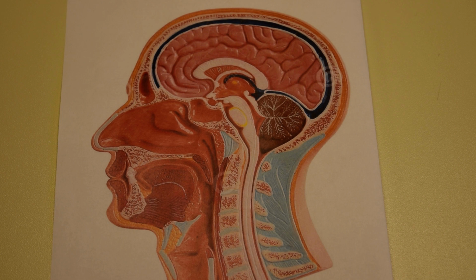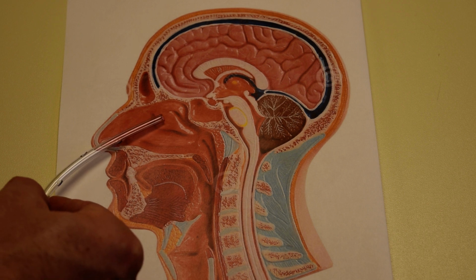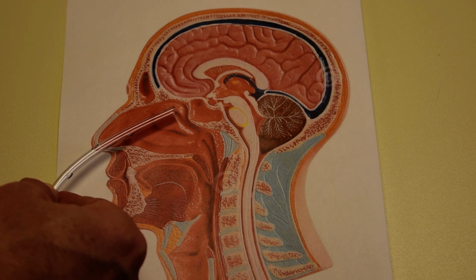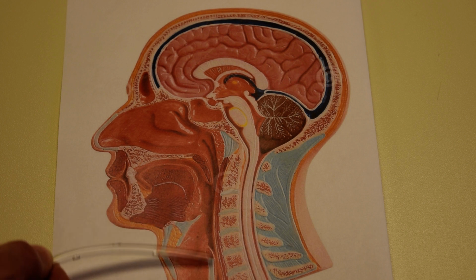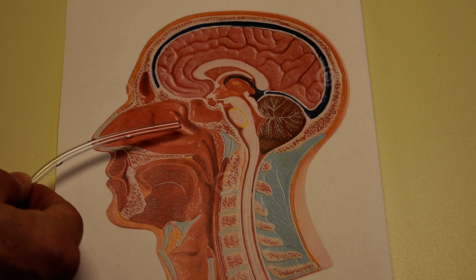Now, I have in front of you a cross-sectional diagram of the anatomy of the human head. And this is the piece I think that most people have a difficult time with. So if I approach this head going upward into the naris with my NG tube, you'll notice that the end of this NG tube is going nowhere near where I want it to. It's not going to go down the nasopharyngeal pathway and into the esophagus. It's going to get jammed up in the posterior of that sinus cavity and cause discomfort and pain.